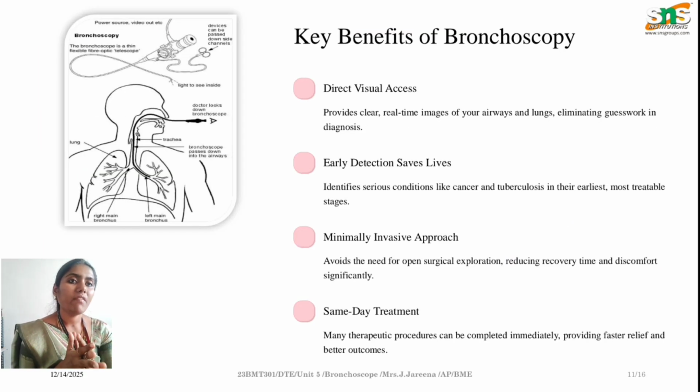Finally, we have very good key benefits of using bronchoscopes. The first, as I said, is direct visual access, which is not easily possible with other X-ray techniques. Then we have early detection, which is very much recommended in the case of very serious diseases like lung cancer and pneumonia. The third one is a minimally invasive approach.